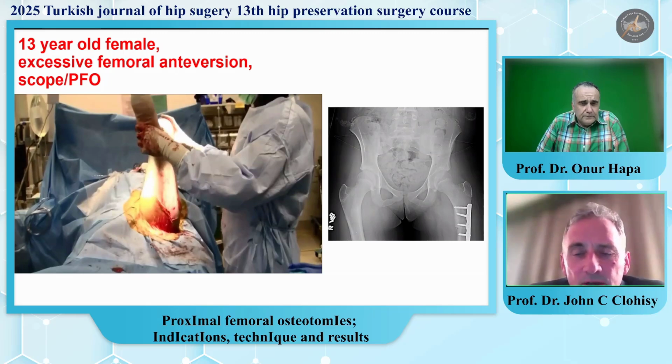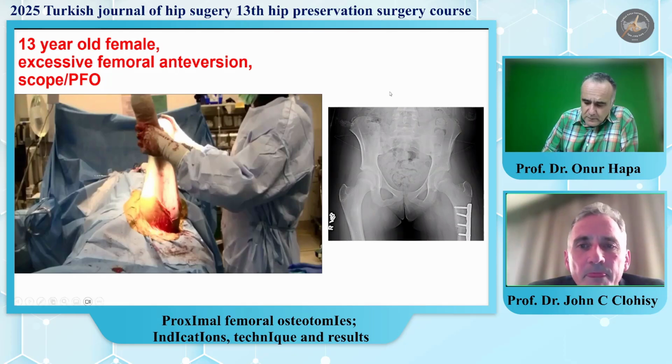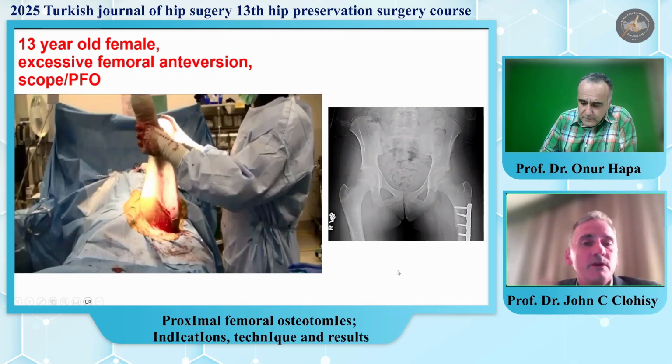Nowadays, in a case like this, I usually make the osteotomy higher. I'll tend to make it just at the inferior aspect of the lesser trochanter, so the plate will go up on the trochanter a bit. I fix the plate proximally with 3 screws. I then loosen the screws, make the osteotomy cut, make the correction, fix the plate proximally with the screws, and then reduce the distal fragment and fix it distally with compression. So that's how I do it if I just do derotation.